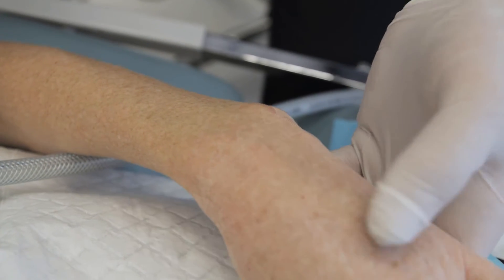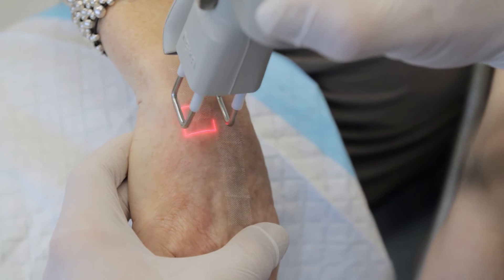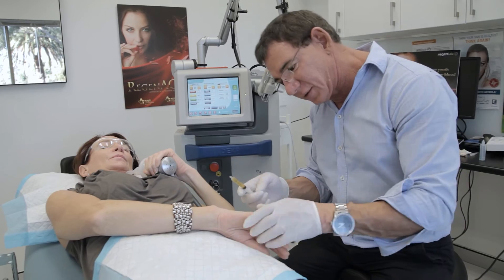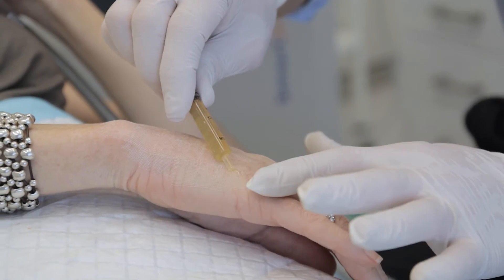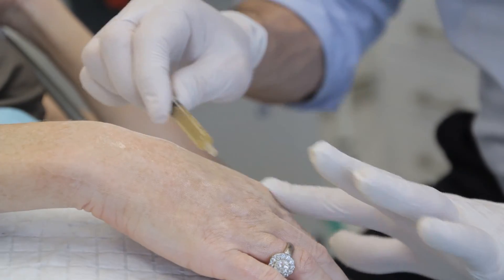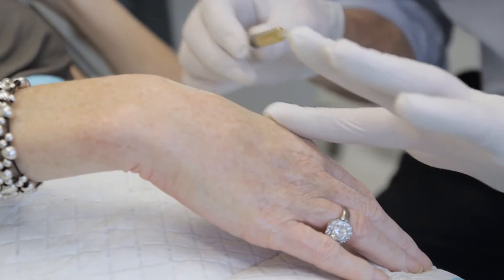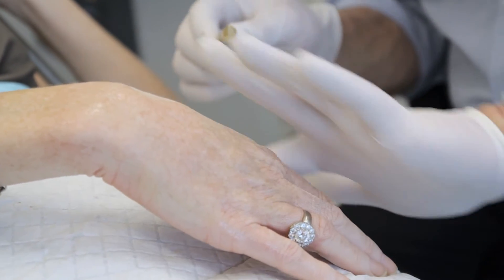As it heals that way it doesn't look like such a glove on there. We're going to use PRP in this situation now as a wound dressing. We've got a freshly lasered area of skin and our platelet-rich plasma, and we're just going to drizzle that onto the skin — it will soak into all the tiny little laser burns like a sponge. The platelets will then lodge in these little burns and release their growth factors, setting up an accelerated healing process. It also shortens the downtime and soothes the discomfort — so if Kate's hands are stinging and feeling hot, the PRP will act as a soother and tend to settle it down.